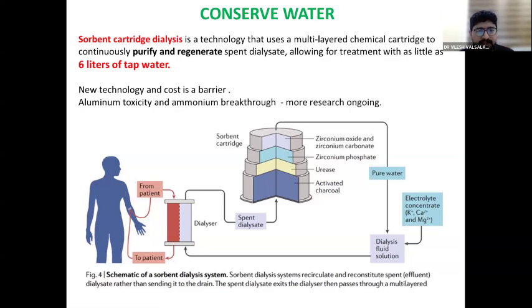This new technology has a cost barrier for sure, and some side effects in the form of aluminum toxicity, and in some places it was seen that there was an ammonium breakthrough. So more research is going on this. But you must know about this dialysate system because that is definitely going to be there in the future.